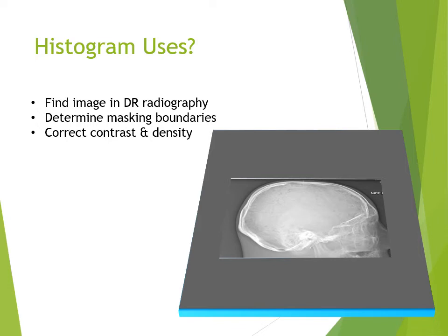Finally, the histogram may be used to evaluate the image relative to the exposure factors used. In today's world, it is difficult to produce an overexposed radiograph. Systems take too dark pixels and can correct them to proper levels. The only indication that a radiographer has that an overexposure has occurred is that the S number, the LGM, or exposure index is out of range. Some of these values may be derived from analysis of the histogram combined with other mathematical characteristics of the image.